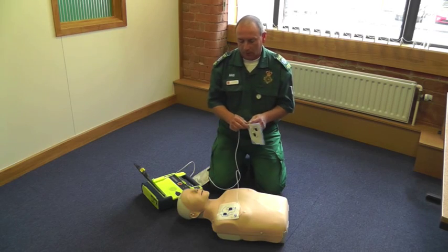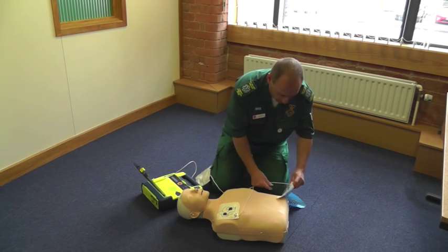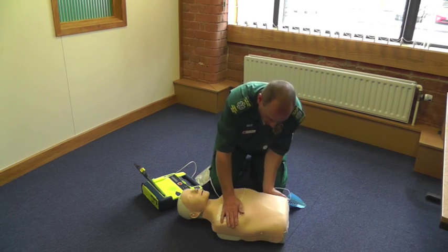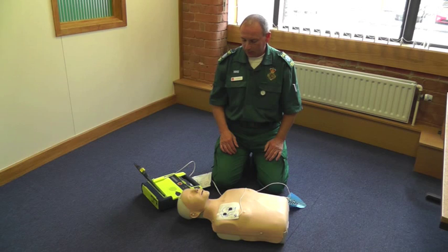Peel second pad and place on bare lower chest, as shown. Do not touch patient — analyzing rhythm.